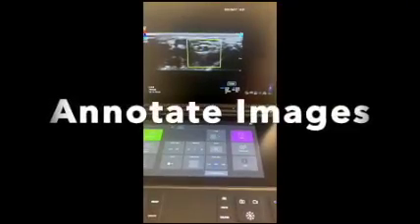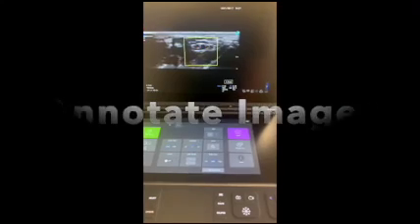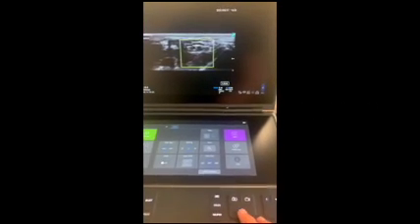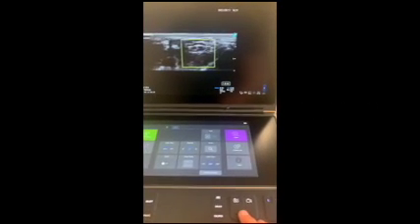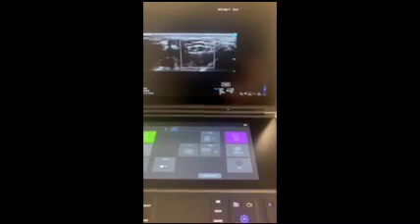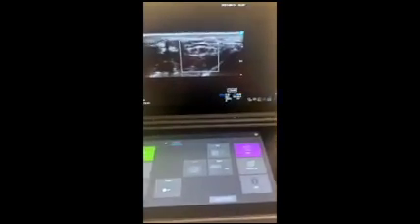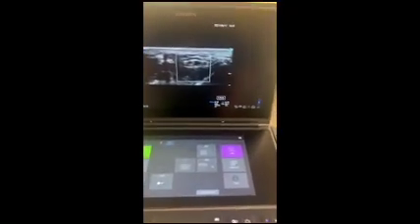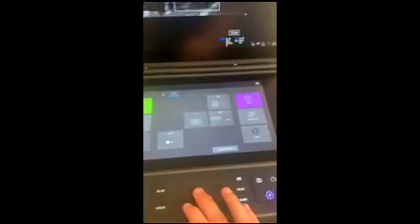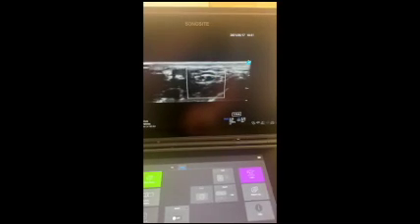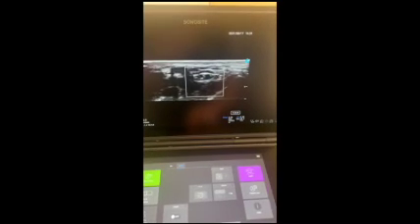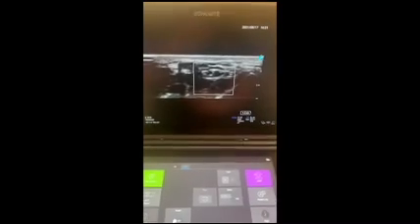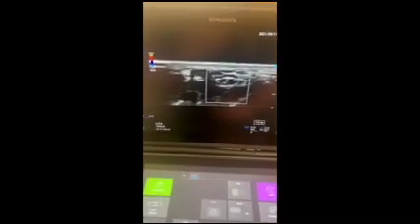Let's say you have a cool image of an artery and you'd like to take a closer look. You can go ahead and click the freeze button. When you do so, the image will freeze. It can be hard to get the exact image that you want, so you can toggle through a clip of the image to get exactly where you like.